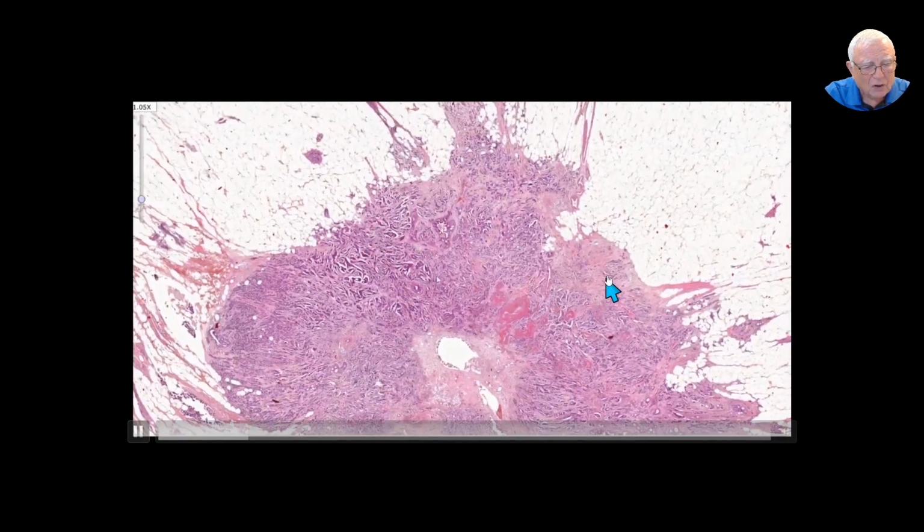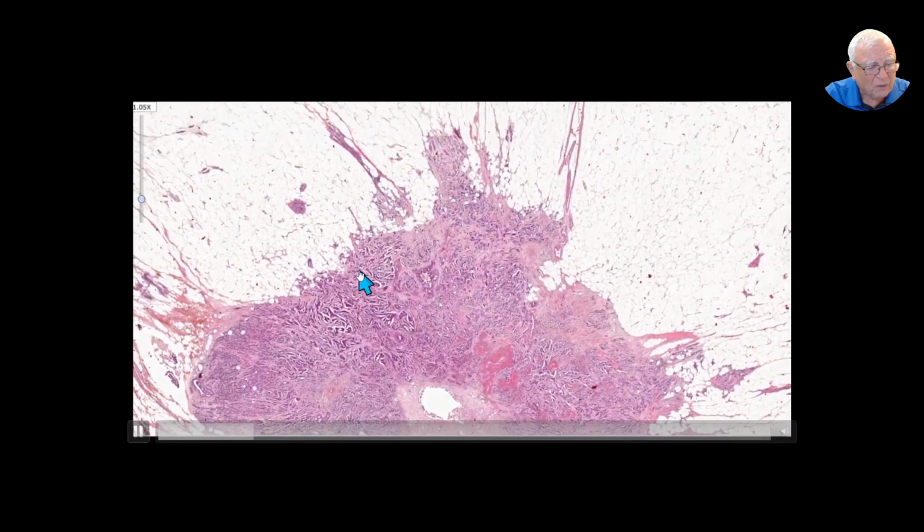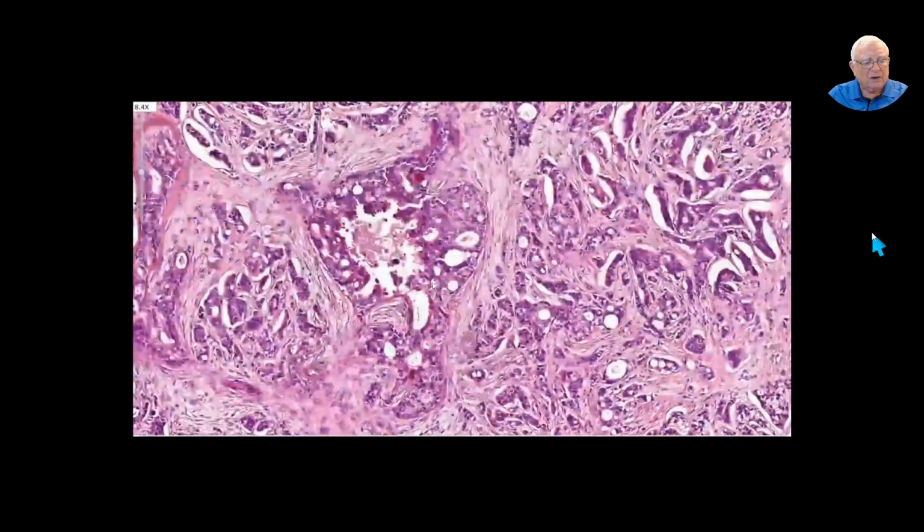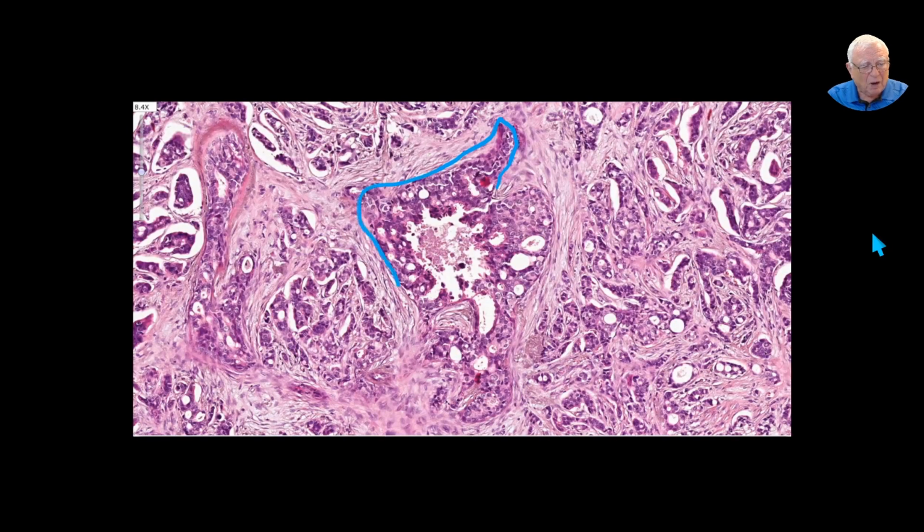The structure here is different from here, is different from there. Oh, here is our mother, not only one, but there is a neighbor as well, acinus. That one I'm drawing in the left side, 9 o'clock position. Here is another one.